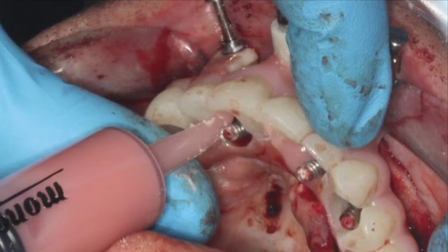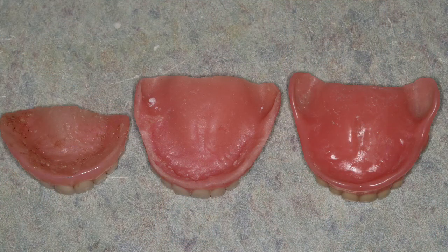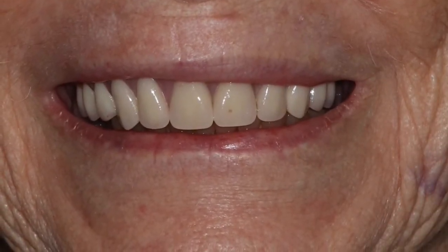Let me introduce you to a patient — we'll just call her Jane. This is the story of three dentures. The one on the left is what she was given at the time of implant placement because two of her implants didn't torque in enough. Then she was so upset with that, they tried to hurry and make her a second denture, which is in the middle. Finally she was referred to me because they just couldn't get it right. Here you see why she was upset with her first set of dentures.